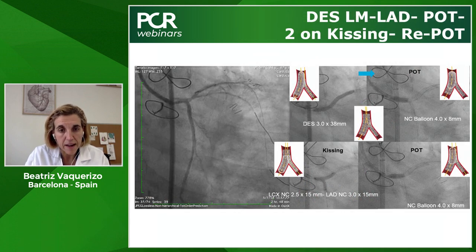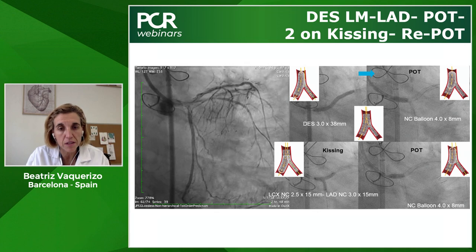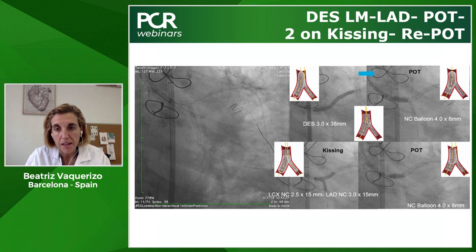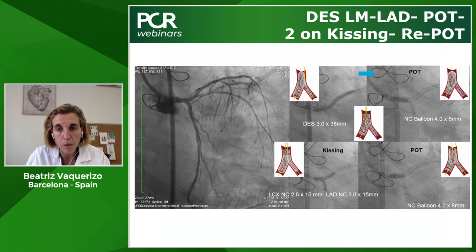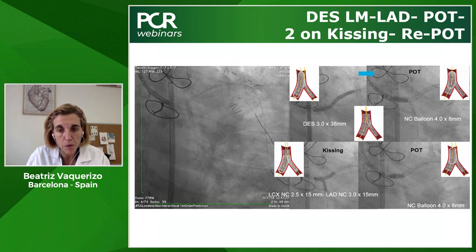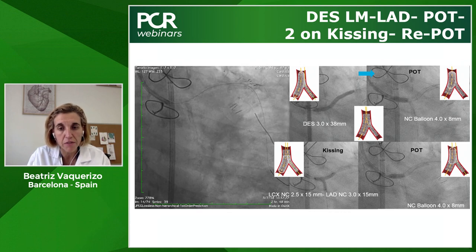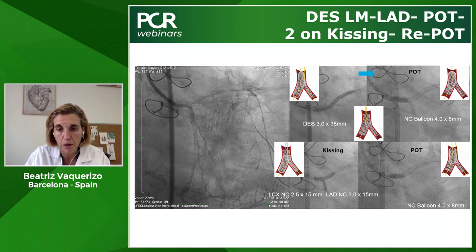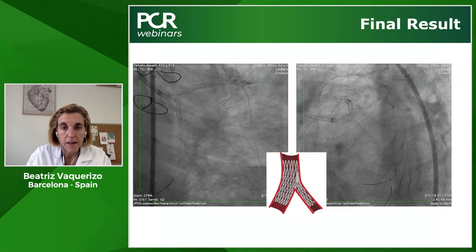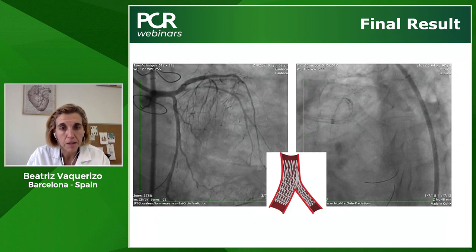After crushing and the first kissing balloon, I implanted the second stent — Resolute Onyx 3.0×38mm from left main to LAD. Then I did POT with a 4.0mm non-compliant balloon, re-crossed wires, and did the second kissing balloon with NC 2.5×15mm to left circumflex and 3.0×15mm to LAD, and finished with a second POT. Here you can see the final result in a caudal view and a spider view — it's really beautiful.